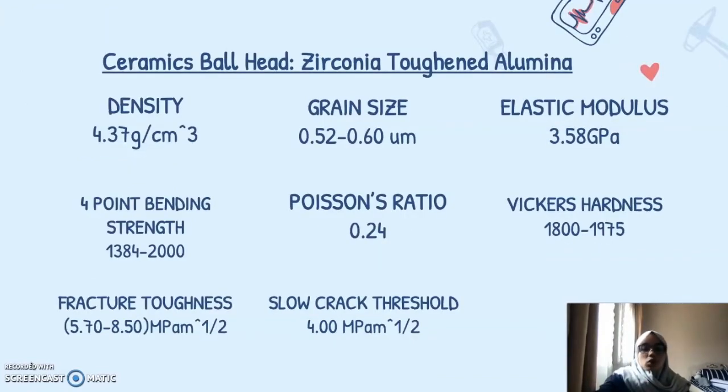The ceramic that we chose is made up of 25% zirconia, 75% alumina, and less than 1% of chromium oxide and strontium oxide to counterbalance the hardness caused by zirconia. These are the properties of the zirconia toughened alumina, and this mixture will provide an increased strength and toughness, increased resistance to cracking, chemical and hydrothermal stability.